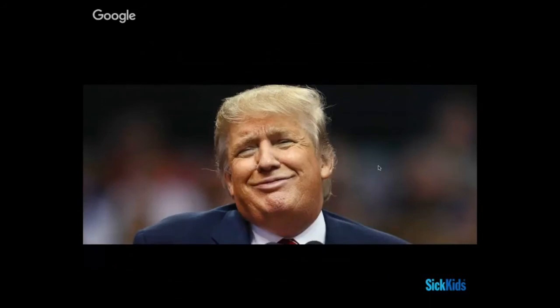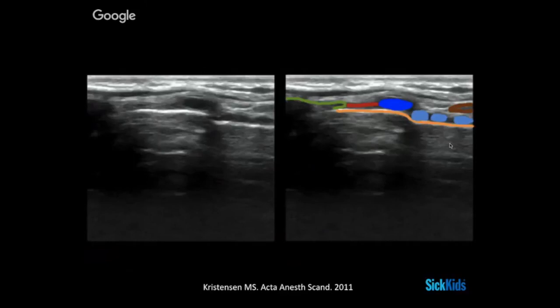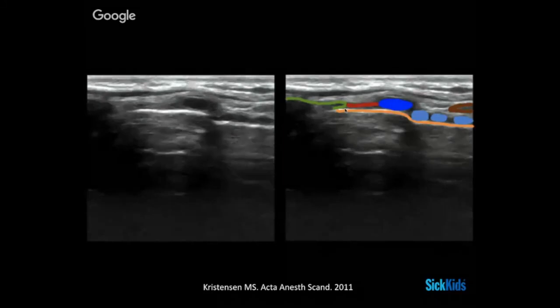On ultrasound you'll see a thyroid cartilage that tends to be a bit bonier - more obstructive to the ultrasound beam - and then between the thyroid and cricoid cartilage is the cricothyroid membrane. There are further cricoid rings that come down like a chain of pearls. In the raw image you've got a more pronounced cartilaginous structure and then small tracheal rings coming around. The area between the thyroid cartilage and the cricoid cartilage is the cricothyroid membrane.